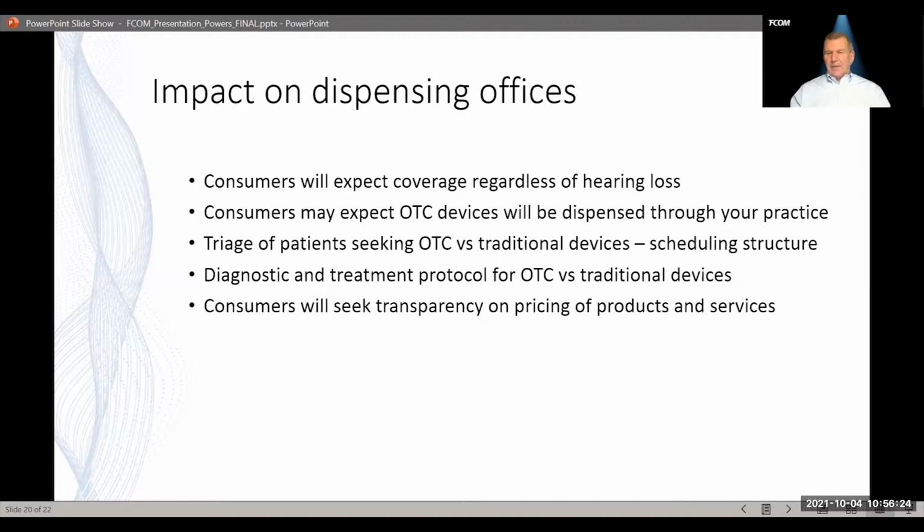So how do we do that in a practice? Do we use the hearing test combined with hearing in noise tests, some questionnaires, hearing handicap inventory, etc.? How are those patients evaluated, and how are they counseled in regards to what type of device would best suit their needs? I think we have always looked at entry level, medium level, and high level devices. I think we may need a fourth category, and that is the OTC devices at the lower end for the mild to moderate, and/or those people that are even on the cusp of normal hearing.